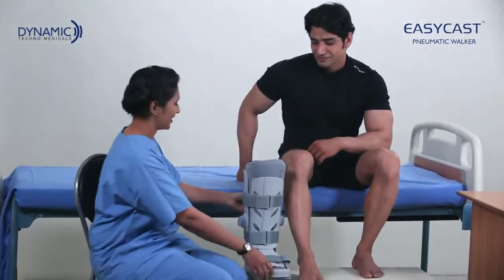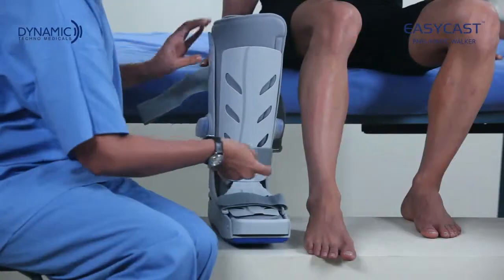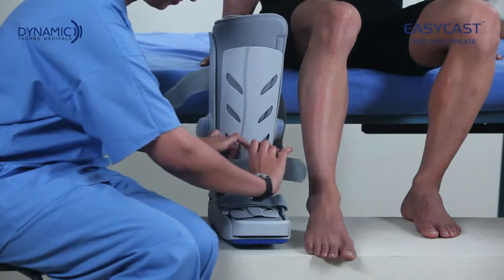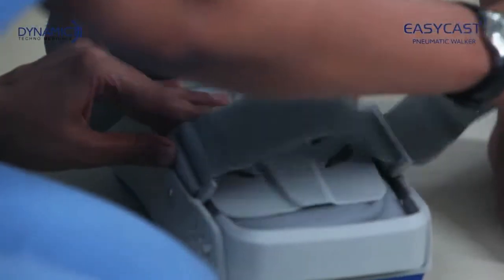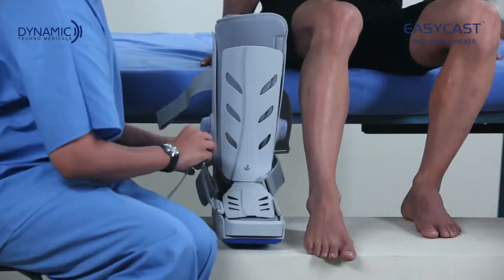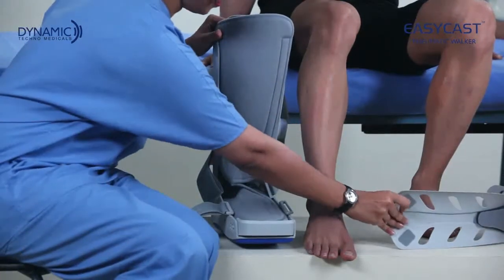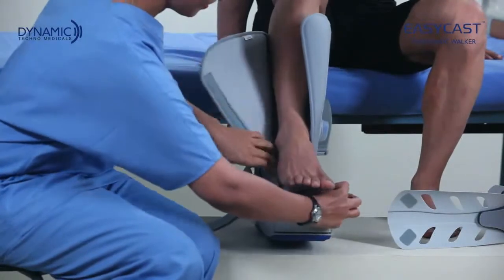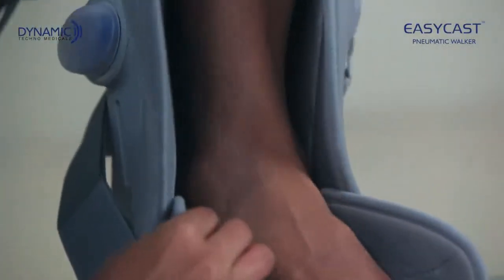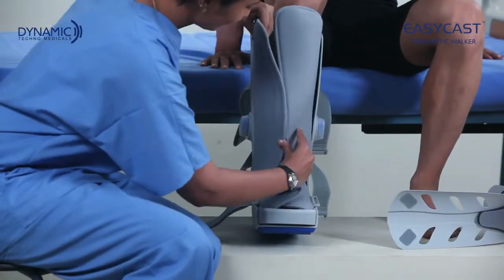To apply EasyCast, unfasten the straps in the front, remove the front panel, and open the foam liner. Place the injured leg inside the foam liner, then wrap the liner first around the foot and then around the calf.